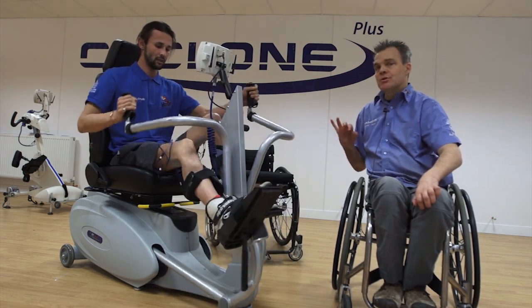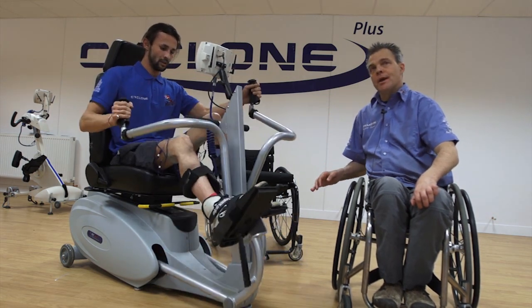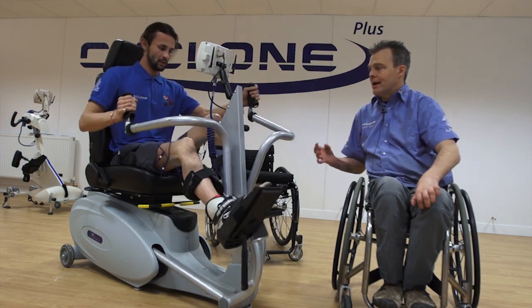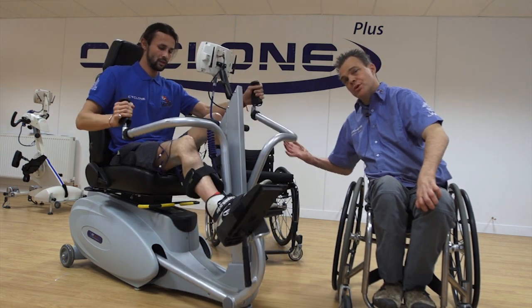I think every independent paraplegic, when they try the RT200 or 300, says exactly what Johnny's just said: this is the one for me, this really is the device I should be using. That smoothness combined with the fact that the whole body's working together — it's something that stands out.